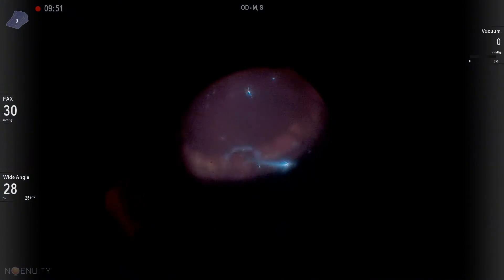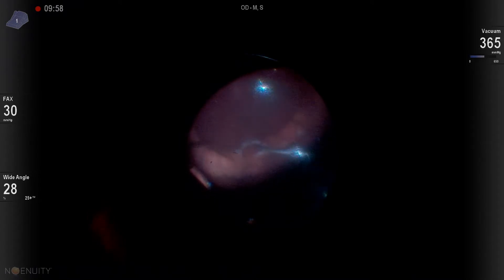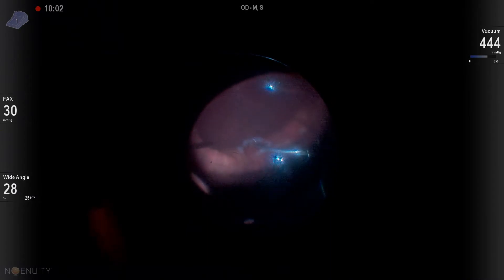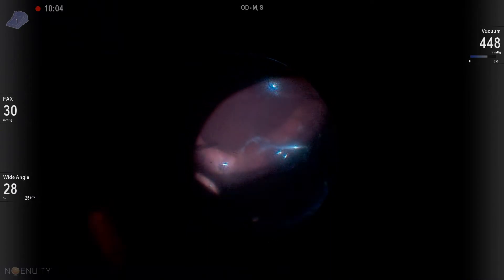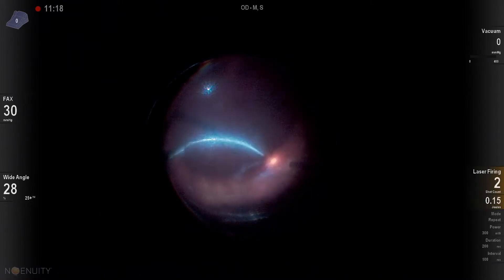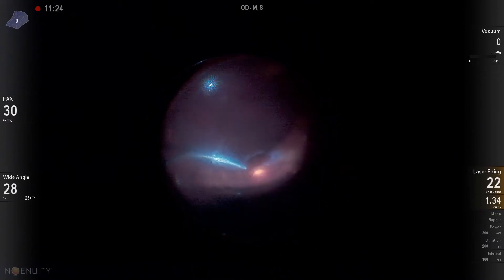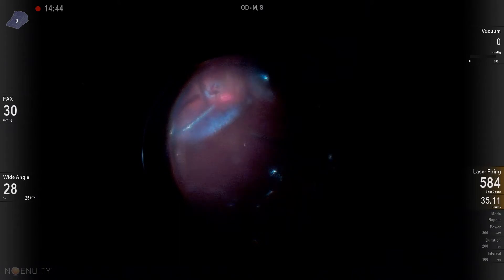We can see here that first I use the cutter over my break as I'm draining. That really helps if you've got some vitreous left over anteriorly and you're having trouble with your soft tip trying to get through that vitreous. You can just use your cutter and that mitigates any kind of vitreous blockage, allowing you to do a little vitrectomy under air, which is never a bad thing. Then we go to our soft tip and drain the patient flat.